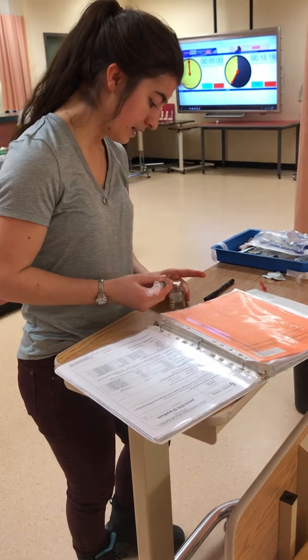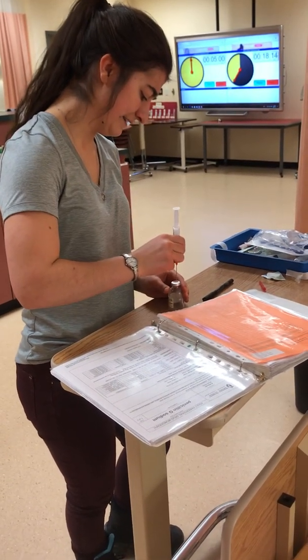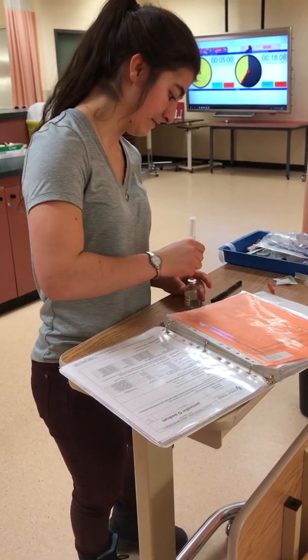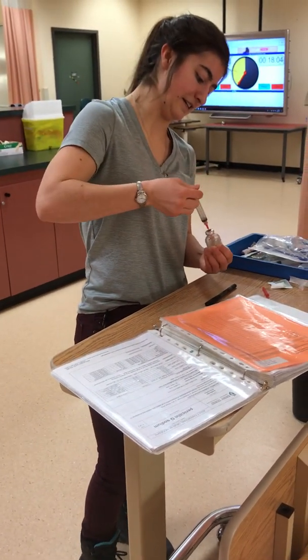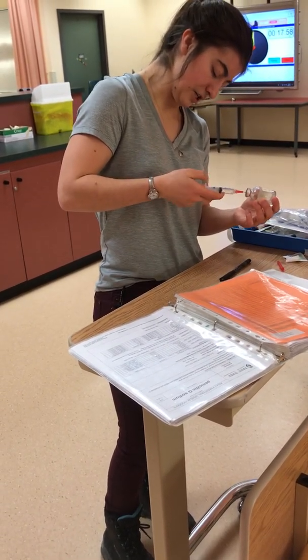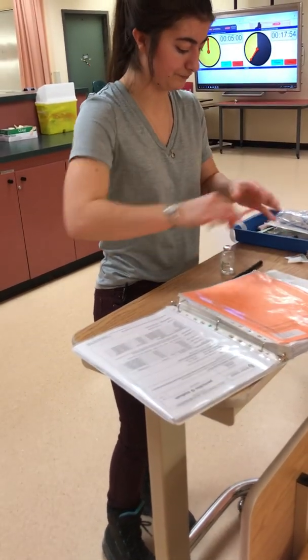And now, sorry, I'm going to clean that again. 30 seconds, let it dry for 15 seconds. Gosh, sorry. And I'm going to reconstitute, and pull that 3.1 mils out of air, just so I'm sure that it's not going to explode with pressure.